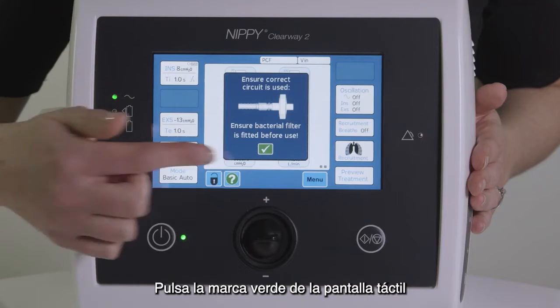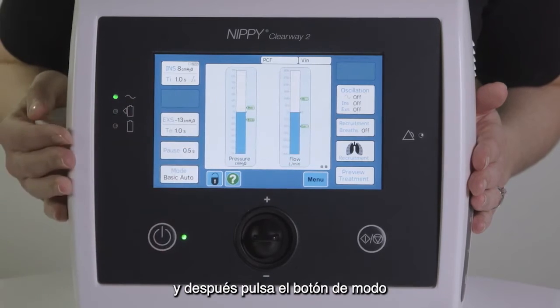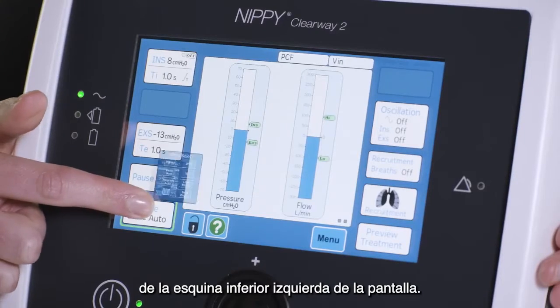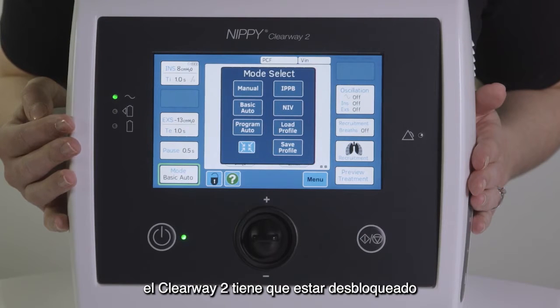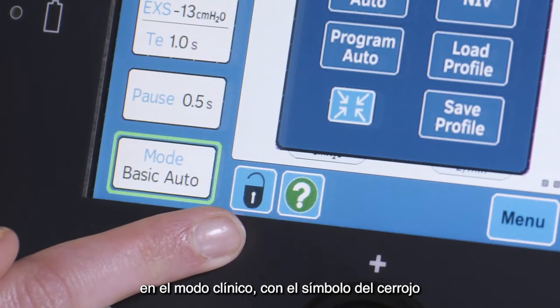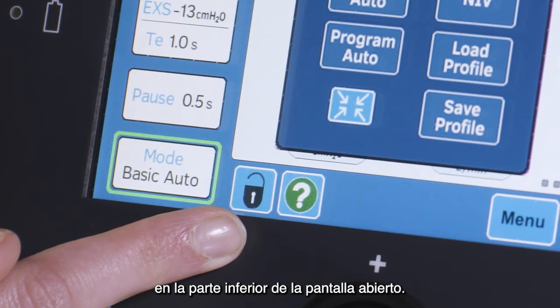Press the green check on the touch screen, then press the mode button in the bottom left hand corner of the screen. Before you can change any settings, the Clearway 2 must be unlocked in the clinical mode, with the padlock symbol in the bottom of the screen open.